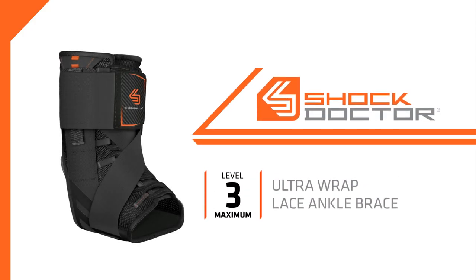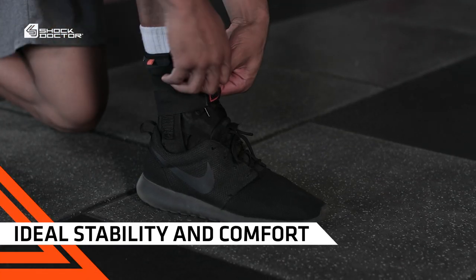The Shock Doctor 851 Ultra Wrap Lace Ankle Brace is a low-profile, level 3 design perfect for the prevention of injury, support, and recovery post-injury. The combination of precision lace therapeutic compression and athletic trainer-like figure 8 strap system provides ideal stability and great comfort.